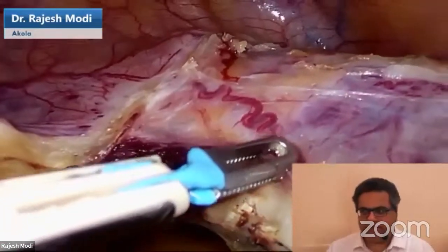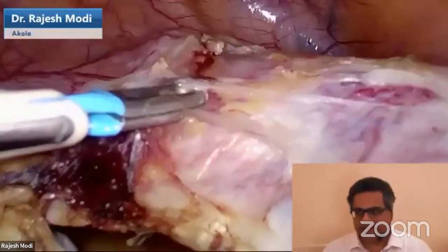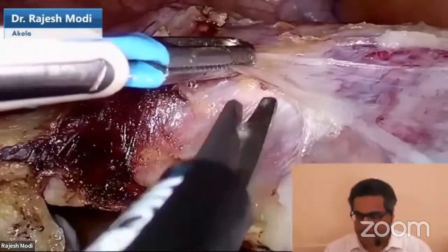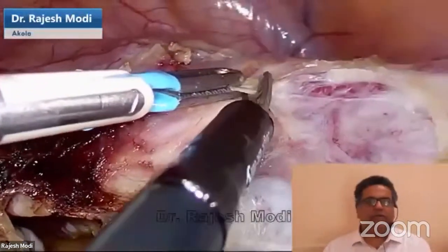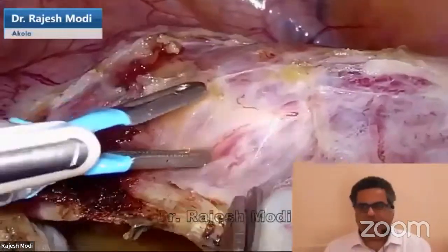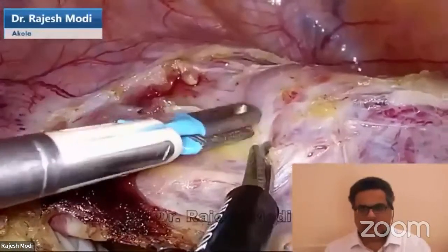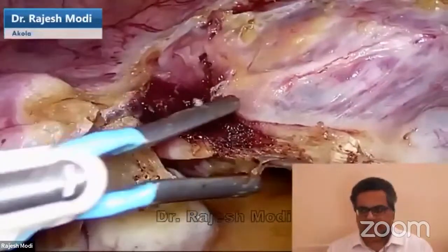So to highlight this, I am going to be talking about the uterine artery dissection or uterine artery skeletonization. Normally when you are doing a hysterectomy, this is the level of dissection you are likely to do: you dissect the uterine by pushing the bladder pillar down anteriorly. I have a habit of going posteriorly also, dissecting the broad ligament up to the level of the uterosacral, even detaching the uterosacral. This is standard for every laparoscopic hysterectomy: anteriorly the bladder is pushed down, posteriorly the broad ligament is slightly pushed down.